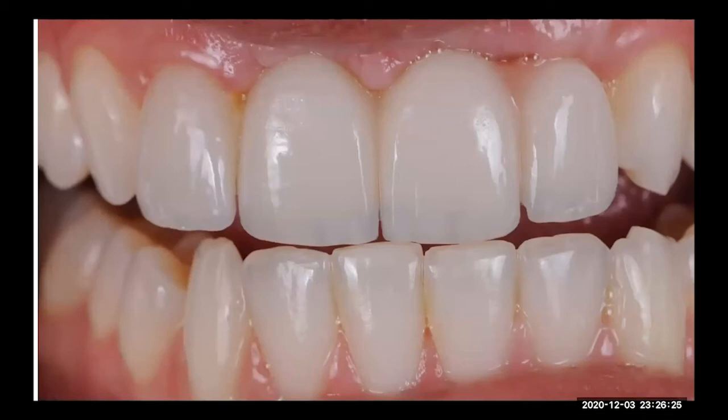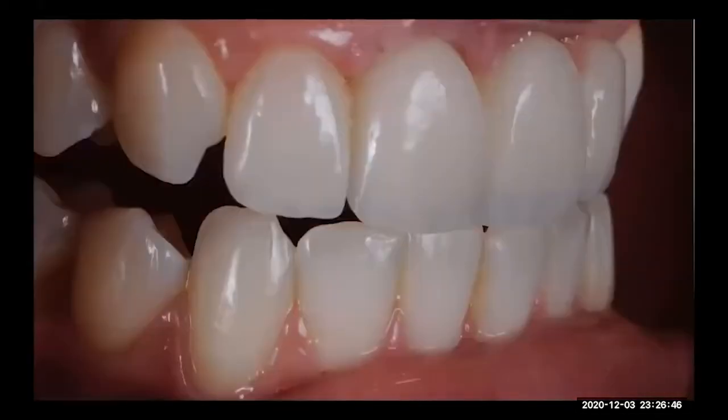Value is really, really important, more when you try to use A1, B1 colors. If you put too much clear or whatever enamel in an amount that is not proper, you will get low value restorations. Okay, so this is the close-up of the restoration.